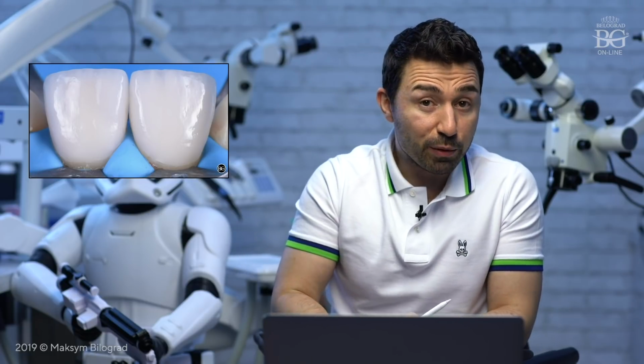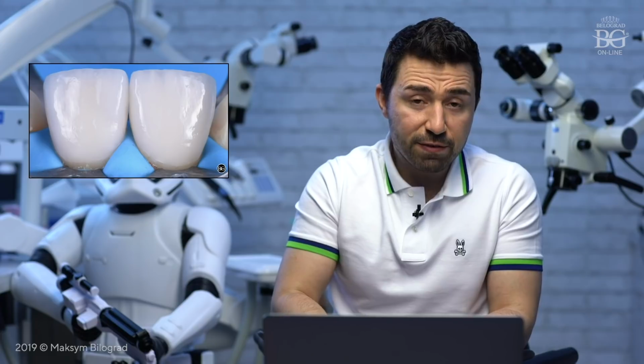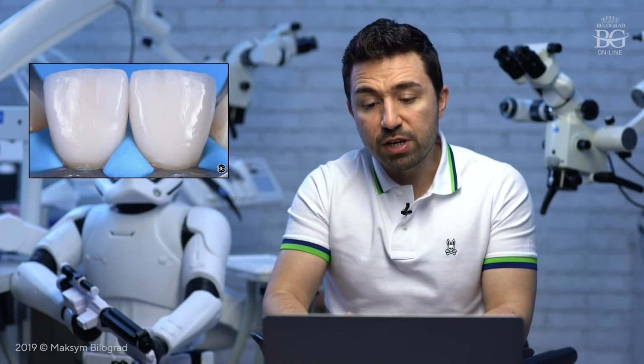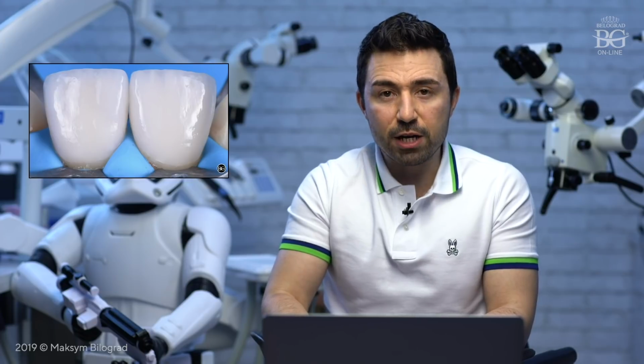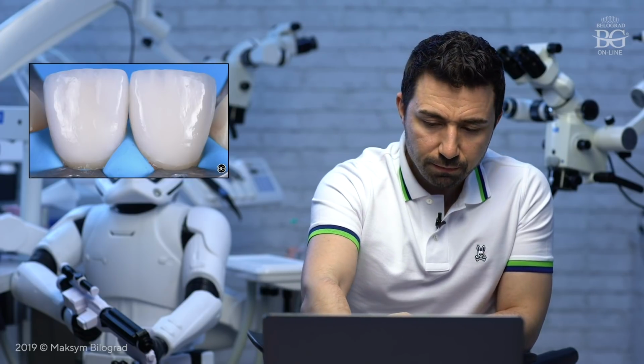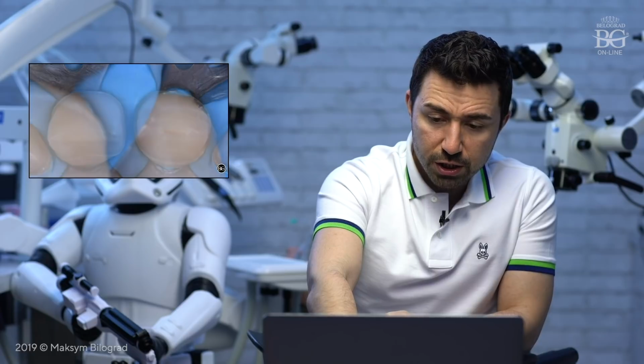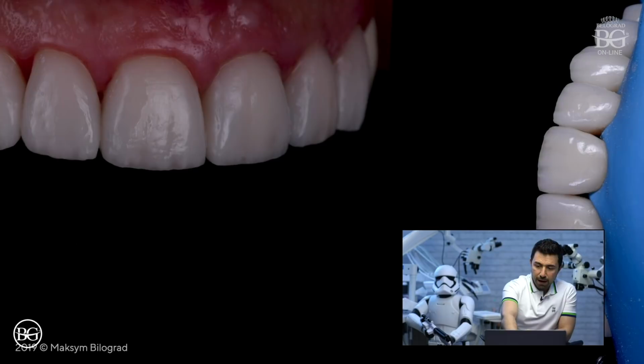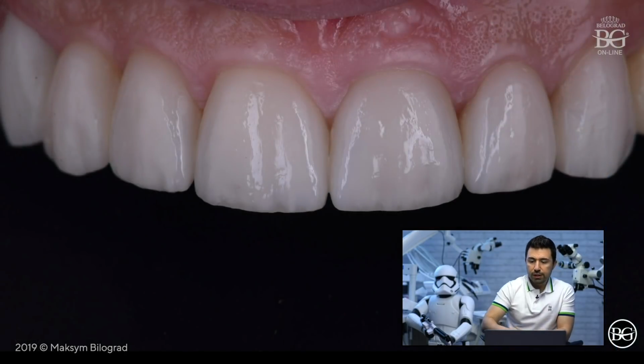So you will not be able to see any defects. So dry fit control really shows you the real data, the real information about fit. Okay, so these are other pictures before cementation, and these are pictures after cementation and after some period of time.